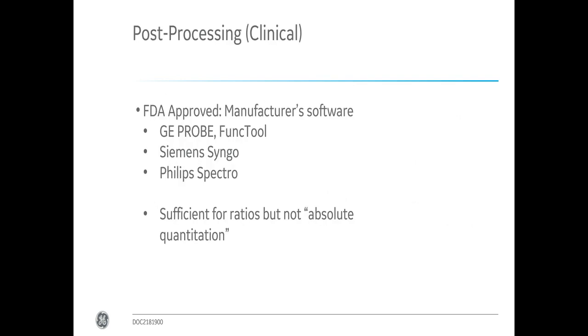So just mentioning at the end that it is important that you know what protocol you should use, and for what diseases you can use either a global or focal protocol, and again, stay consistent with your protocol and acquire good data.